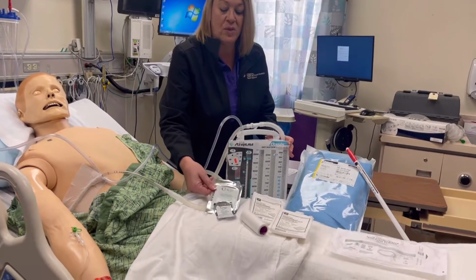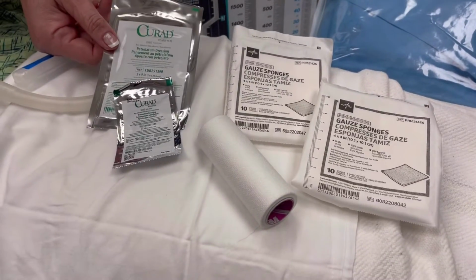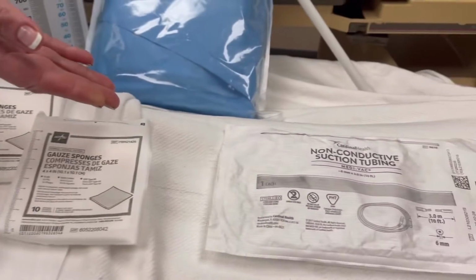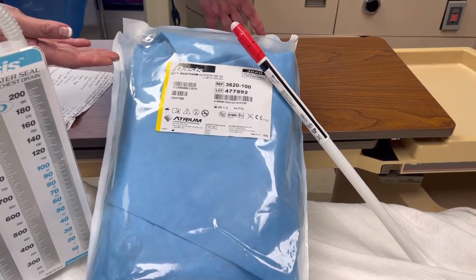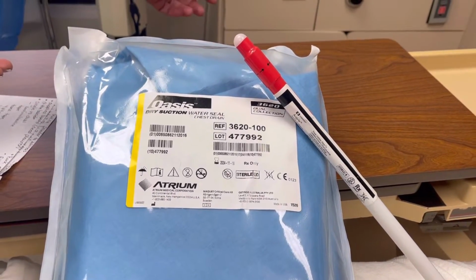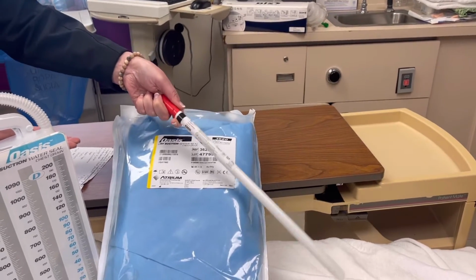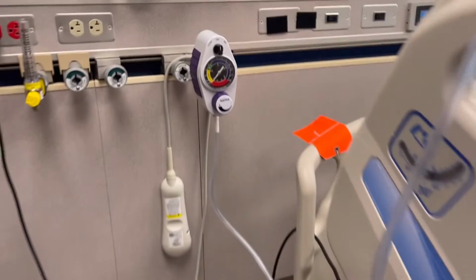So you will note some of the supplies that you'll have to have at the bedside. You're going to need some petrolatum or Xeroform dressing. You're going to need gauze sponges, Mefix tape, suction tubing. You'll need, of course, your Atrium Oasis dry suction. This happens to be a dual collection. Typically you'll see single collection. The Trocar, which actually has the chest tube in it, this is what actually goes into the patient. You'll need a suction regulator, a suction setup, and suction tubing.